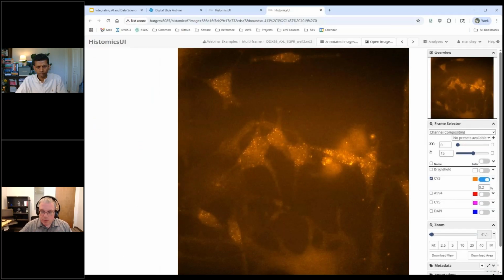You can work on whatever research projects you are developing and customize it to review them. Many of the plugins, some of them, are unaware of multi-frame images. So the fact that this has a Z-stack, it might not know. Some plugins will just operate on the first Z-slice. Others are aware, so you can say, hey, I'd like to take this particular slice. We have the ability to pass what you picked here into an algorithm.